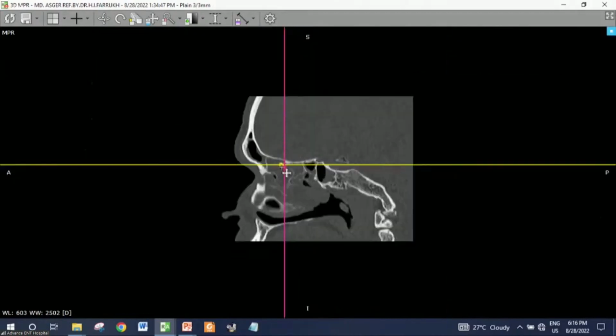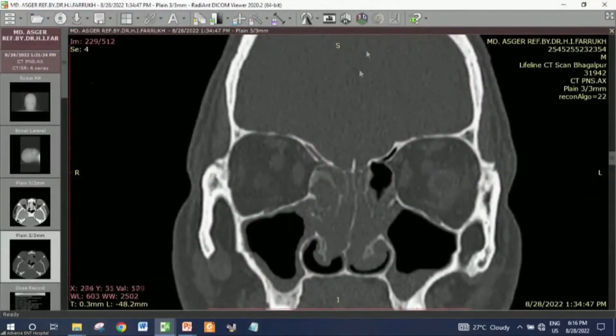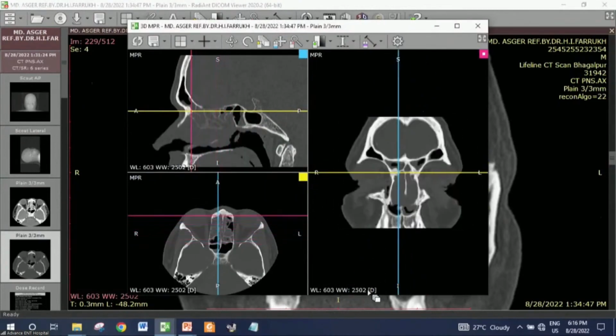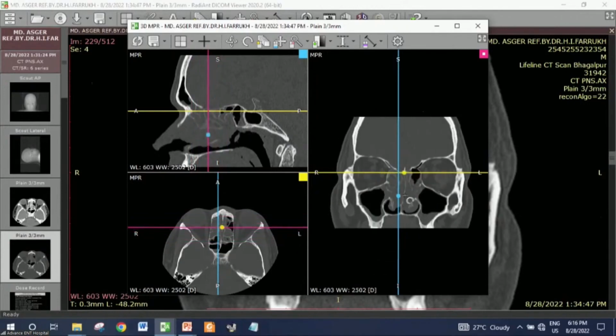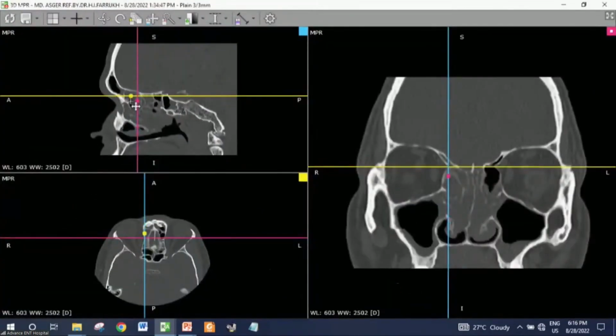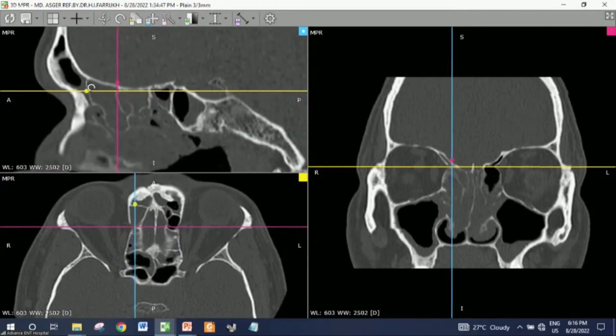And now see. You can see that now, and that is behind this frontobulbar cell. See the level of the vessel. And the beauty of this DICOM viewer is that you can create multiplanar cuts and see it in all the different views. See, this is your frontobulbar cell. And this vessel is behind that, caudal to it.